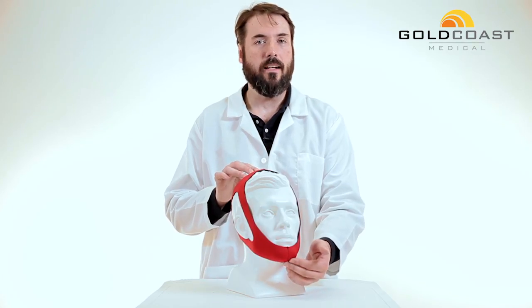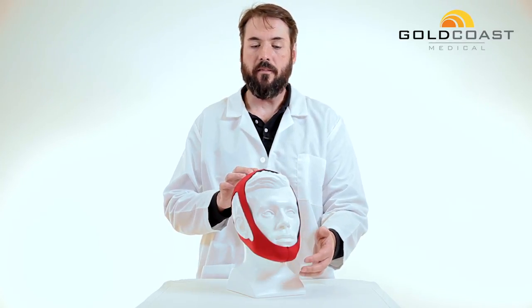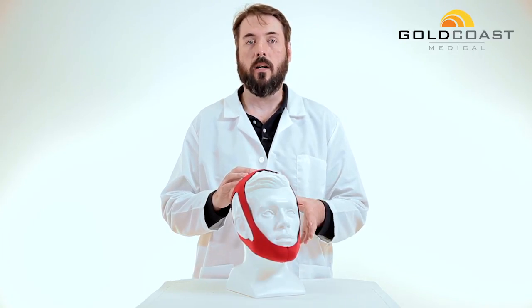If the measurement comes out to 10 to 11 inches, you would want a small chin strap. From 11 to 12 inches, you would want a medium chin strap. And 12 to 13 inches, you'll want a large.